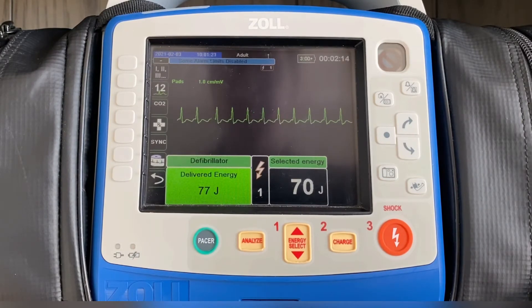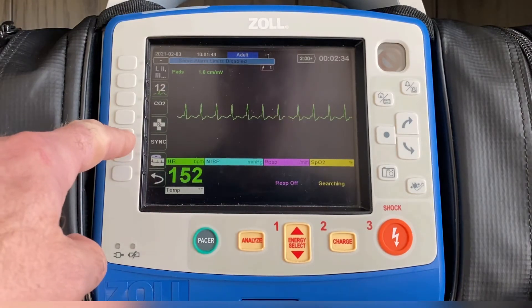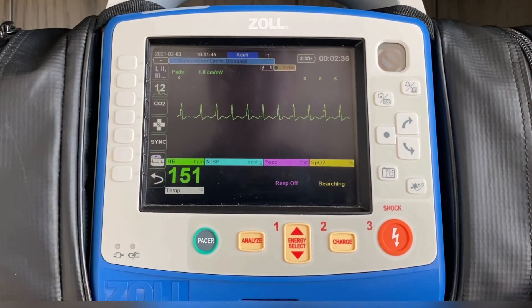The time that it takes to hold that button in will be dictated by the width of the QRS complex that you're trying to cardiovert. You'll notice after the energy is delivered, the sync indicators go away. So if you've not successfully cardioverted that patient and you're going to deliver energy again, it's important to hit the sync button again and make sure you see the sync flashing and the peak of that R wave is marked with the S.